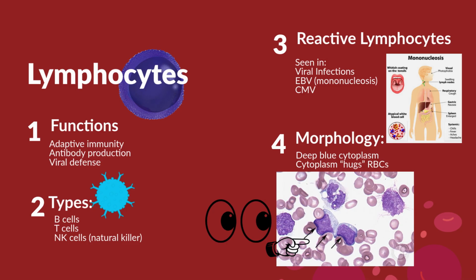Sometimes we get a set and we're like, oh my gosh, this is going to be easy. Oh, they shouldn't have had all these lymphocytes here. The memory trick is CLL is crowded with little lymphs. I know when I see a bunch of little small lymphocytes everywhere, it's a problem. That is CLL. Too many crowded little lymphs. Crowded little lymphs is what it stands for, CLL.